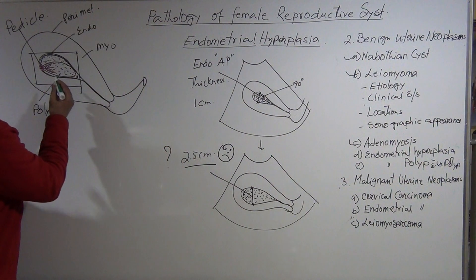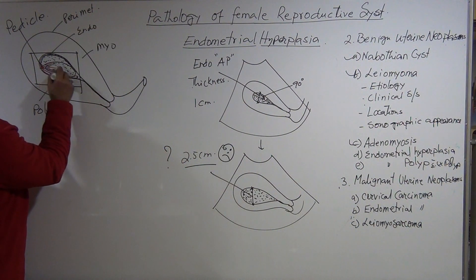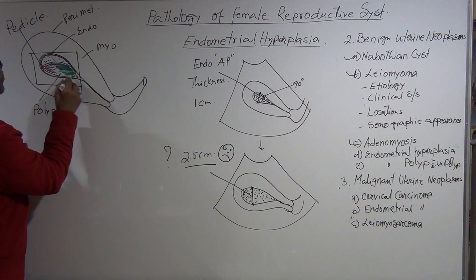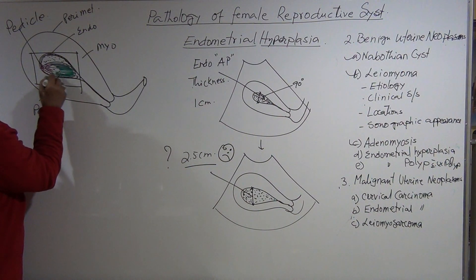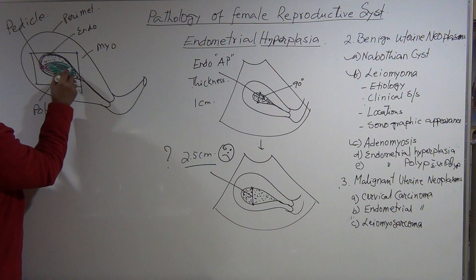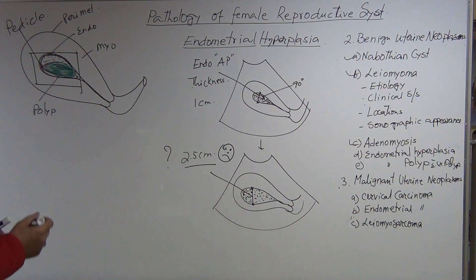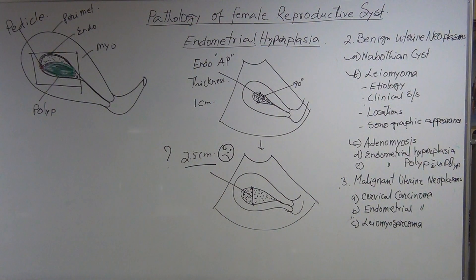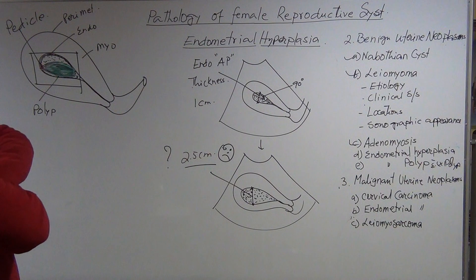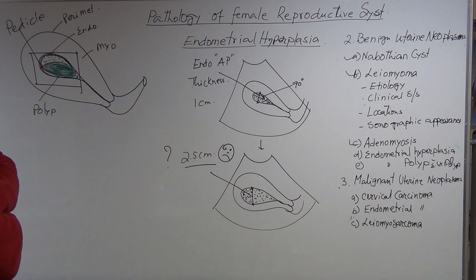This is a polyp with a smooth border, hypoechoic, homogeneous, with a pedicle. There are blood vessels passing through the pedicle. This is a polyp, but I want to confirm it.